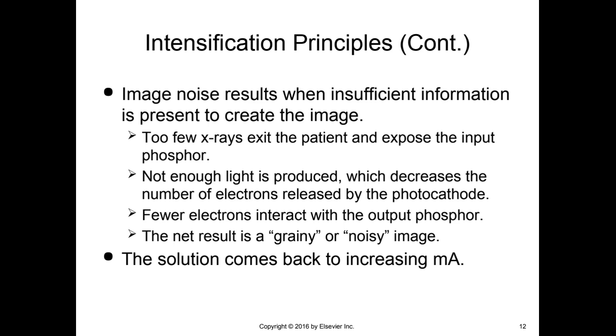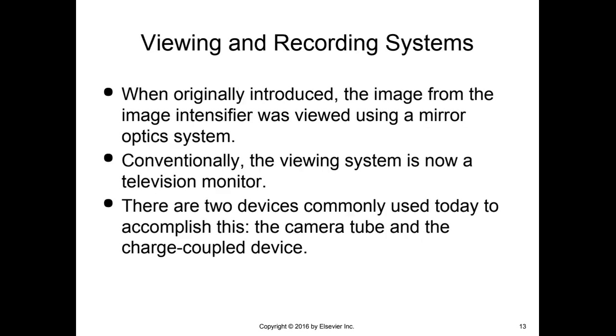This is the last slide I'm going to go over before I open up our Cloverleaf Learning. This is your viewing and recording system. With our fluoro, of course, we have to be able to see those images. And whenever the radiologist wants to review or read those images, he has to have a way to do so. When we're viewing our images for fluoro, there is a monitor in the room. It is a closed circuit television feature.